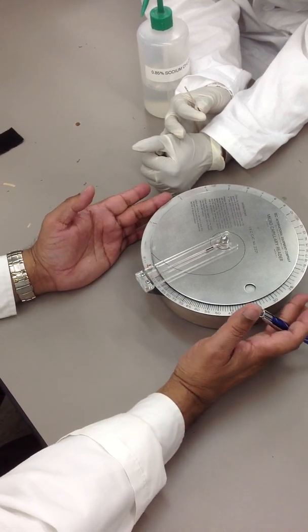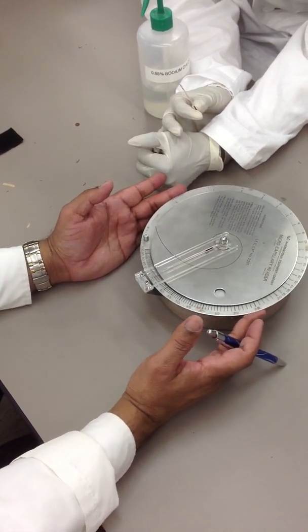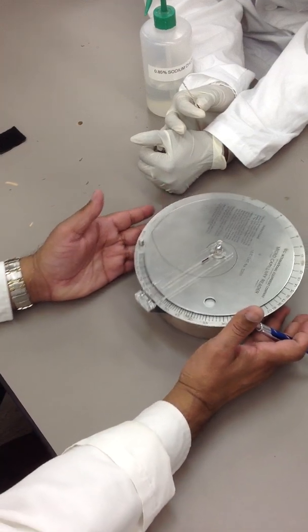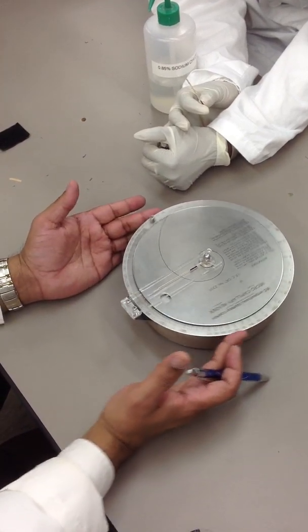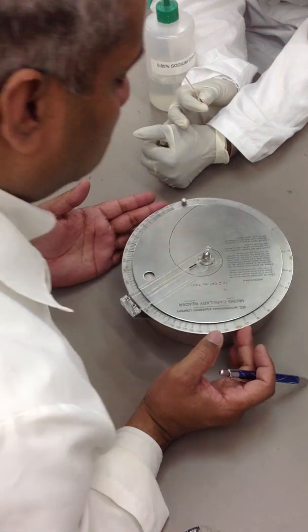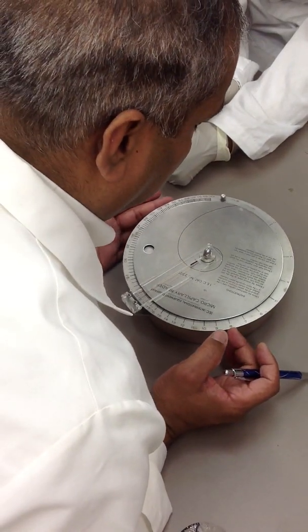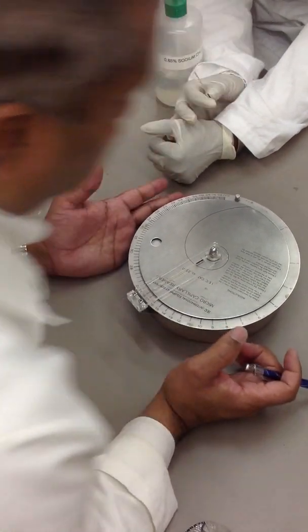Then, all you have to do now is rotate the whole plate. The bottom plate and the top plate rotates together. Okay? Until it crosses now the cell-plasma interface.